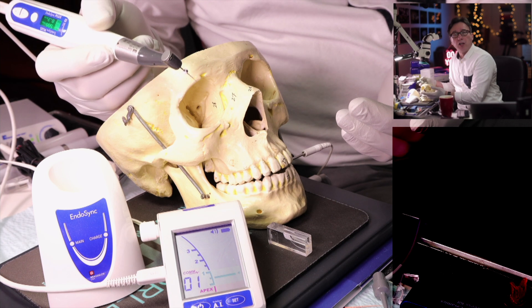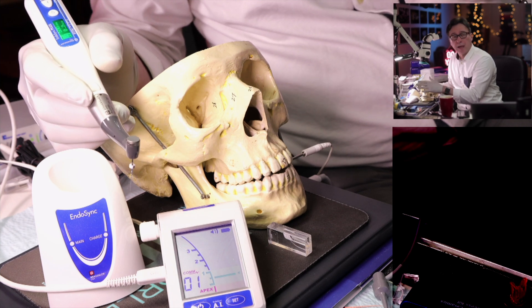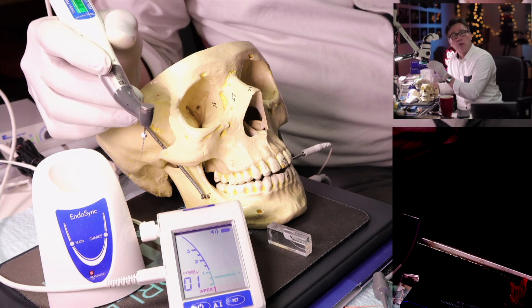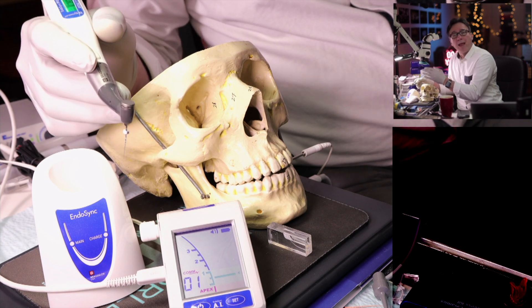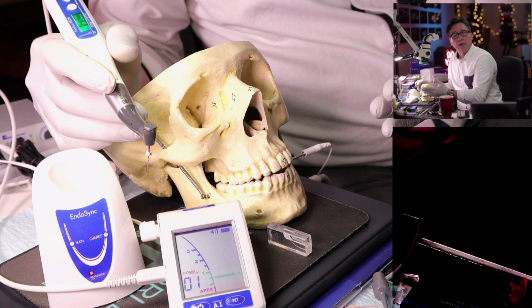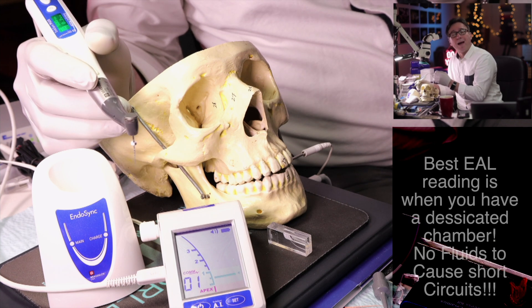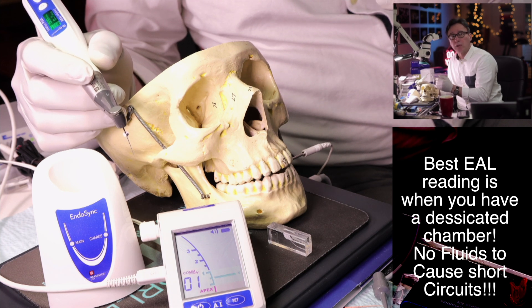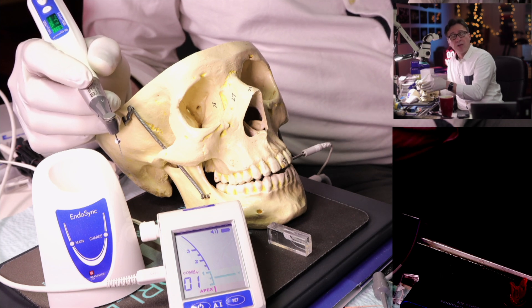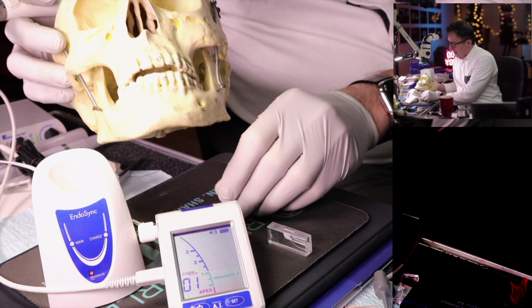When measuring working length, I first irrigate and then completely dry the chamber — including a little bit into the top portion of the root canal — because as you drop the file in, the fluid level will rise. For the most accurate apex locator reading, the chamber must be completely desiccated. You only want fluid in the apical half of the root canal, so when you add the file, the fluid level rises appropriately.